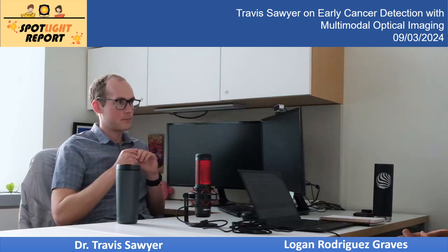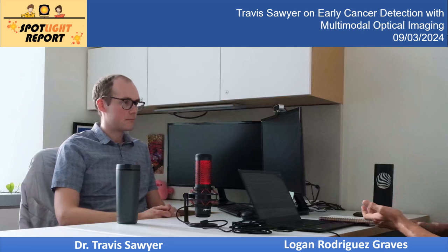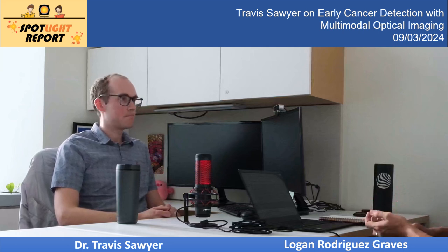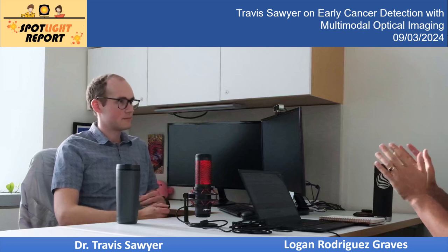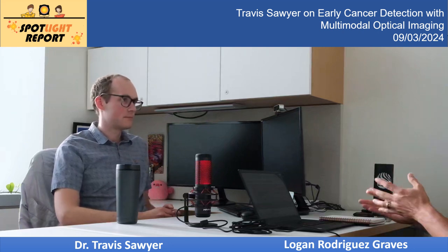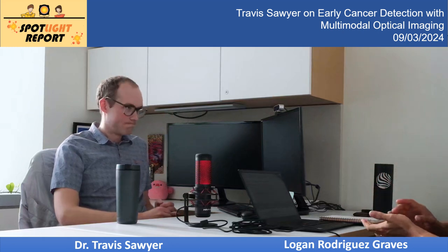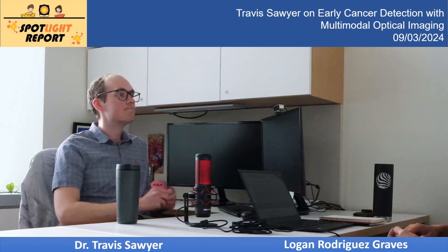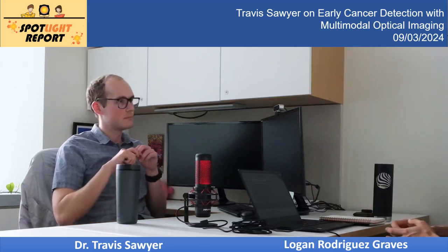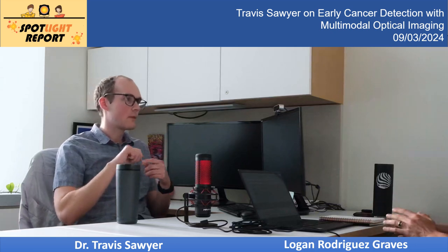And so there's a trade-off with OCT, which you mentioned in your dissertation. There are three key things that you highlighted. You care about lateral resolution. That makes sense. Am I trying to look at something extremely small, or maybe a slightly larger microstructure or millimeter size structure? The delta Z, so the axial resolution that you can resolve, and then the depth of penetration. And so I think you mentioned the trade-off on wavelength and how that plays in. So do you mind just discussing that a little bit?